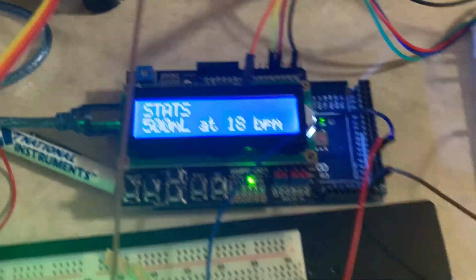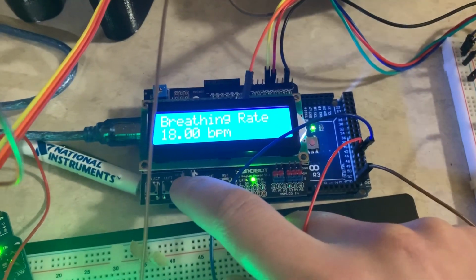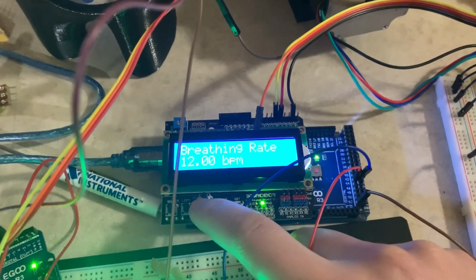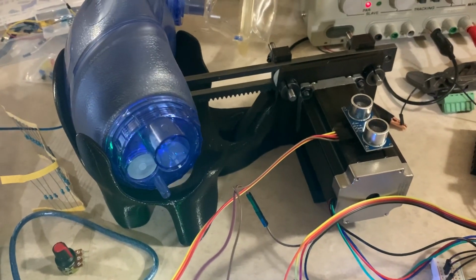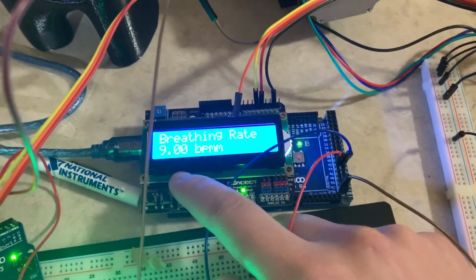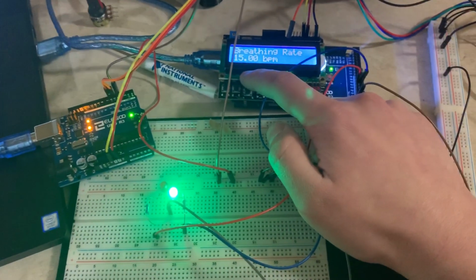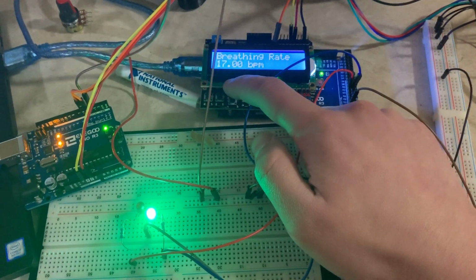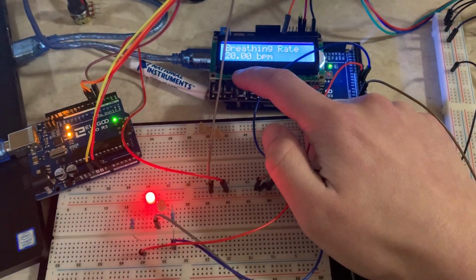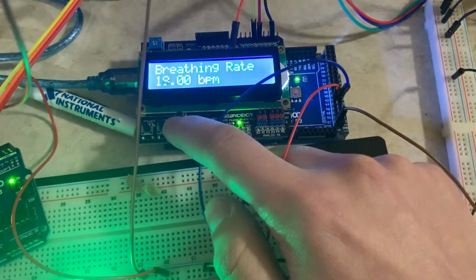So the parameters that should be controlled are the breathing rate, so the breaths per minute, which we can see if we decrease this way down. It's moving much slower now. Increase that back up. Oh, and if we surpass the maximum suggested of 19, so once we hit 20, you can see this light here turns red to warn us that we might harm the patient.